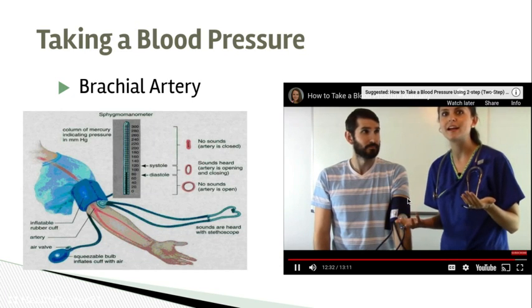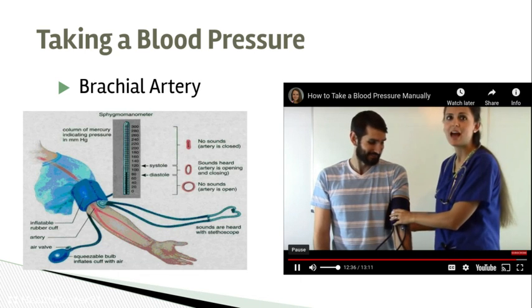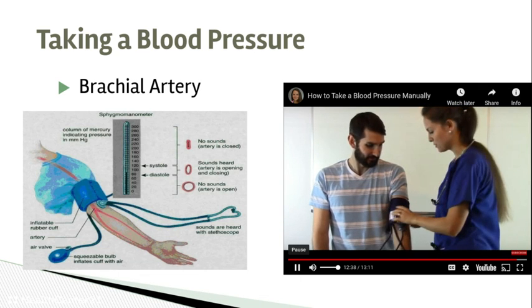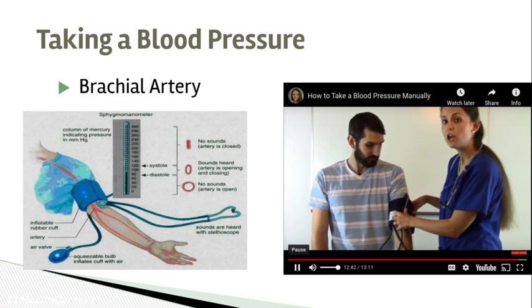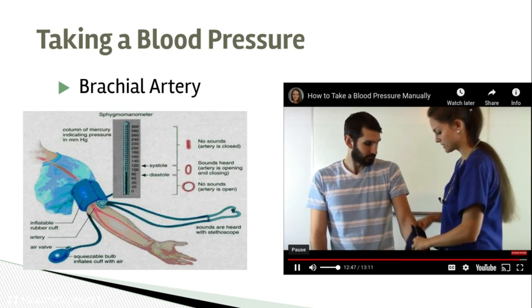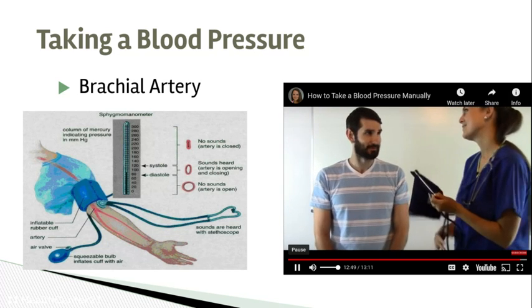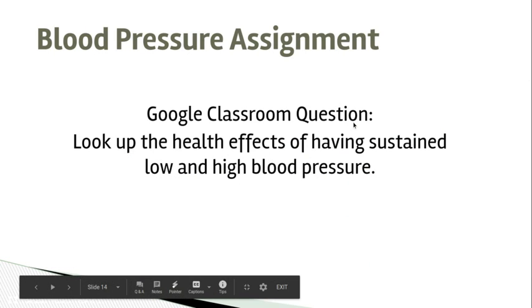And always tell the patient what their blood pressure is, because a lot of people like to know. I know I've been in hospital settings and no one's told me what my blood pressure was, and I would have loved to know. And then of course take the cuff off of them. If you have to repeat the blood pressure, you can do it in about 5 minutes, and it's good to switch arms. So thank you so much, Ben, for being my test dummy. All right, so that's how you take a blood pressure.